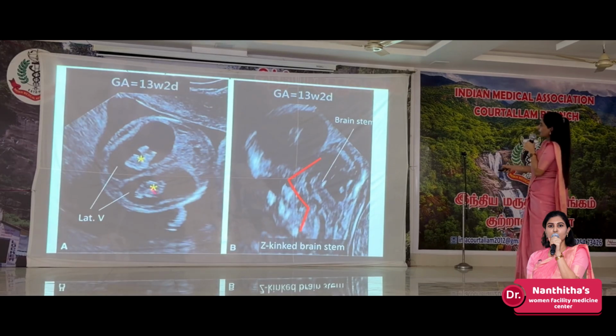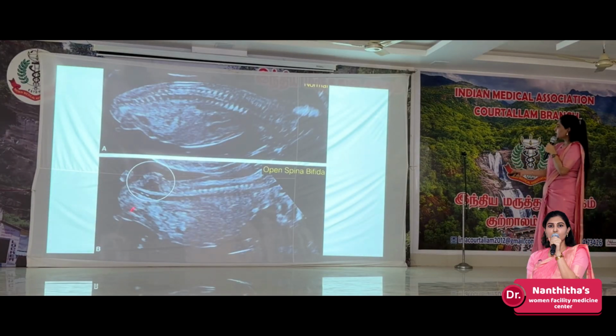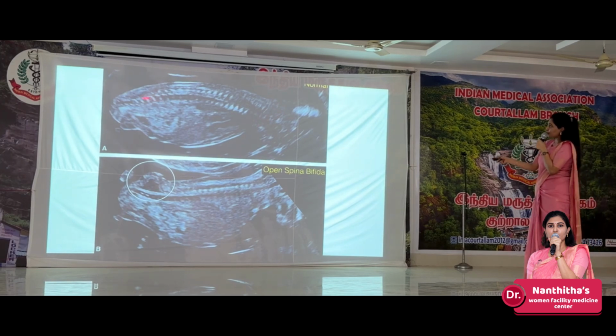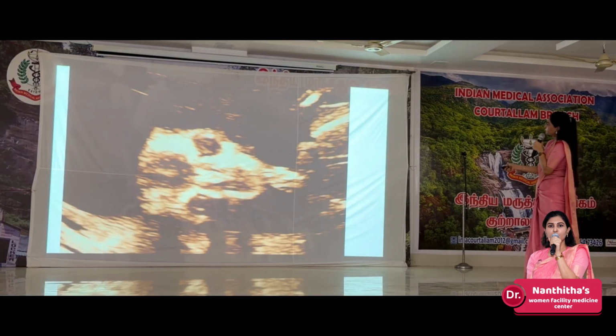This is a case of hydrocephalus with kinked brainstem. This is a case of Walker-Warburg syndrome. This is a case of open spina bifida. You have to document the spine in both sagittal and coronal section. See, this is a coronal section.